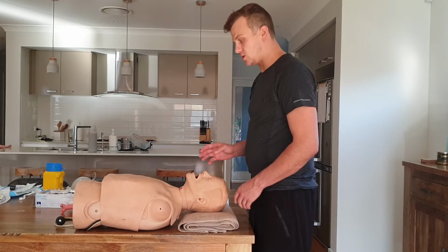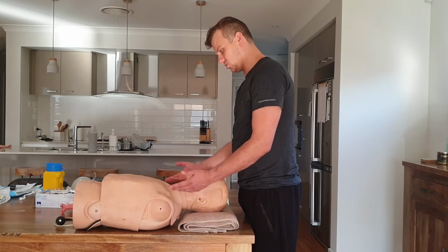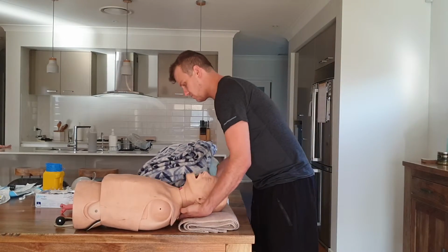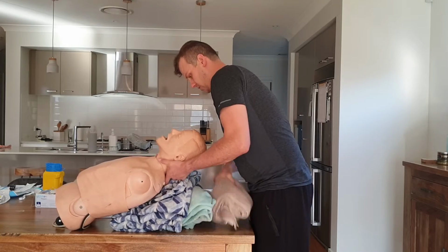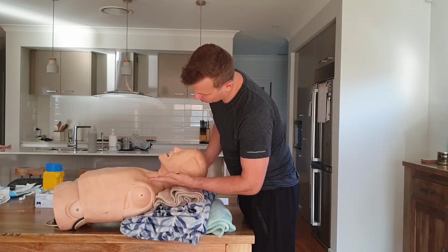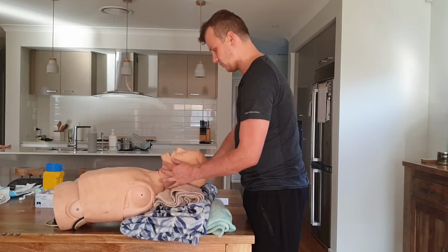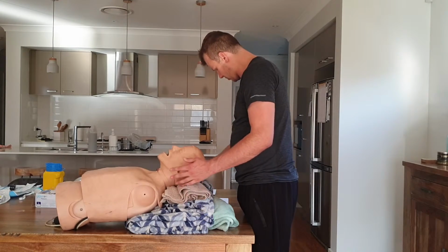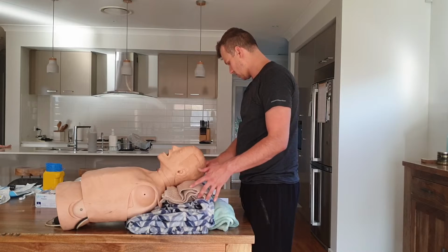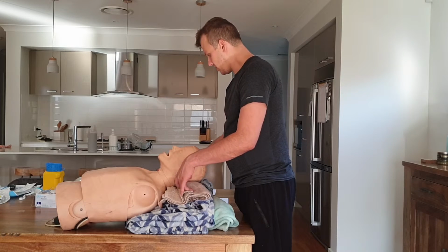The next one is ramping. This puts you in a position to align the auditory meatus and the sternal notch in a horizontal plane. To do that, I'm just going to grab some blankets. We're going to use this to place underneath the patient here. And I'm going to roll the towel and place it here so that when he comes in line, the auditory meatus is in line with the sternal notch there. What that does is align your pharyngeal, laryngeal and oral axes, and it assists in intubation and airway management of the patient as well.